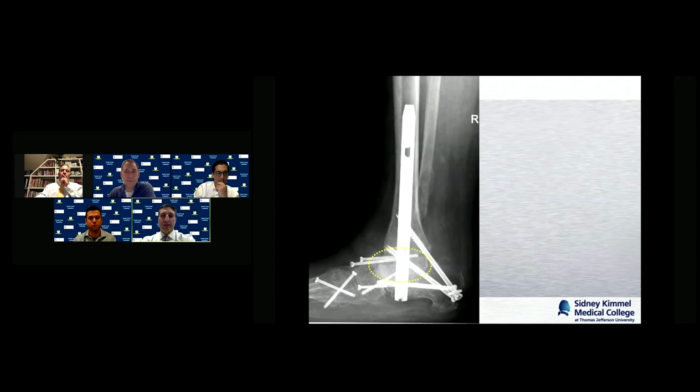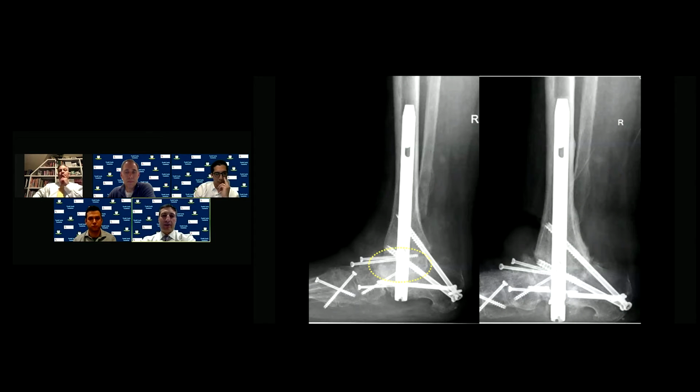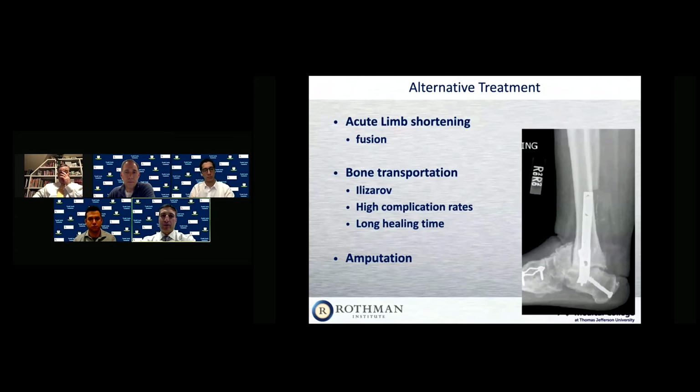And they're stable. So this is just a case of mine where I did a bulk femoral head allograft a few years back. She had complete talar body collapse. I did a bulk allograft reconstruction, and unfortunately, despite protecting her weight bearing for a period of time, that bulk allograft dissolved and obviously led to hardware failure. This is not the case I'm referring to, but it shows that the bulk allograft is not the messiah.